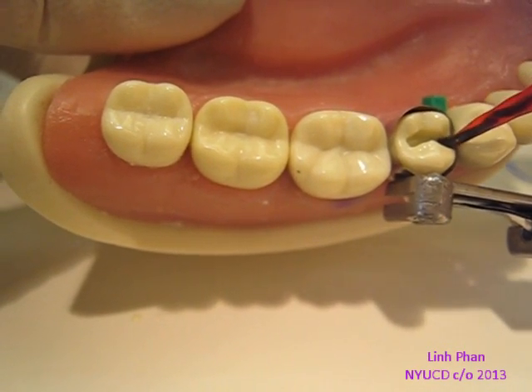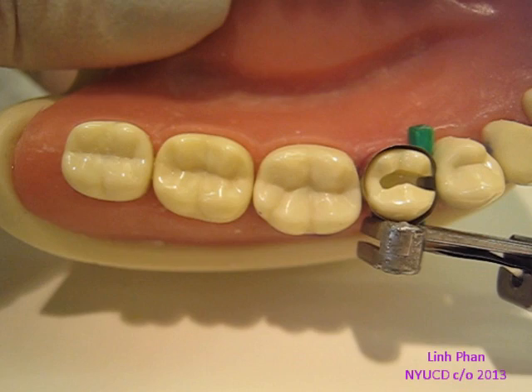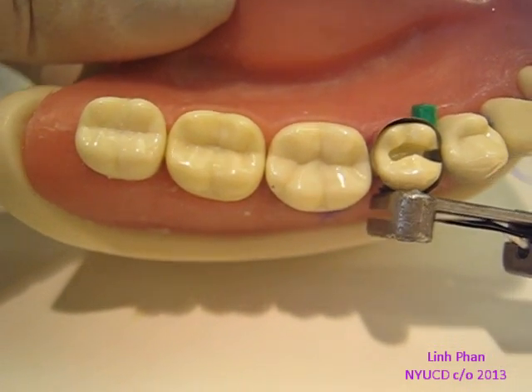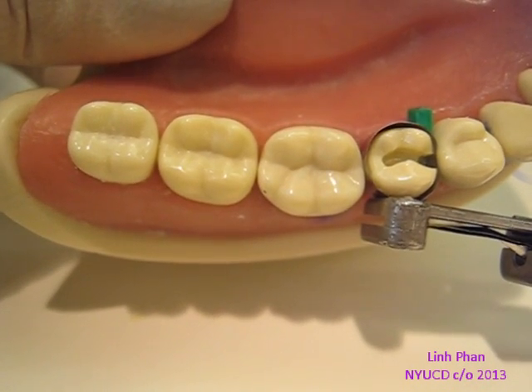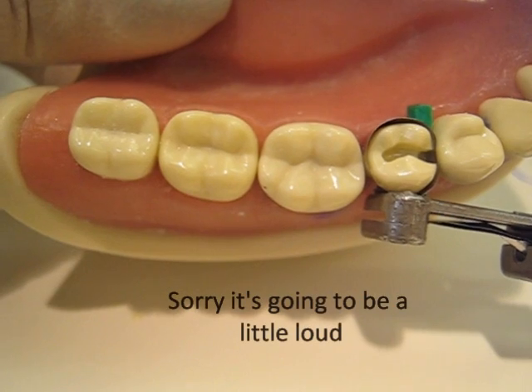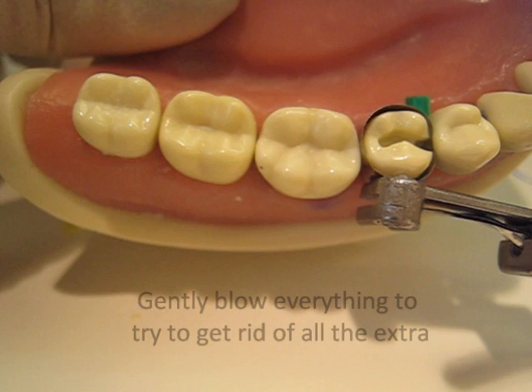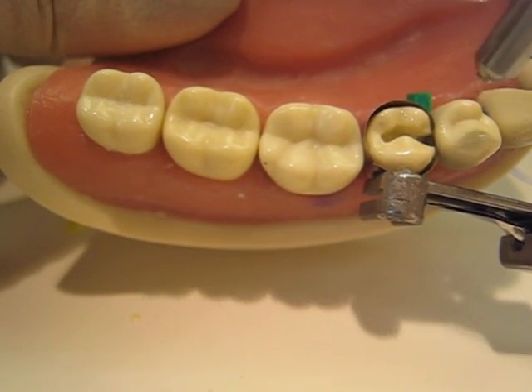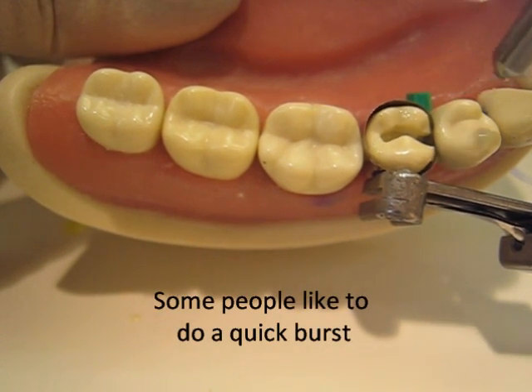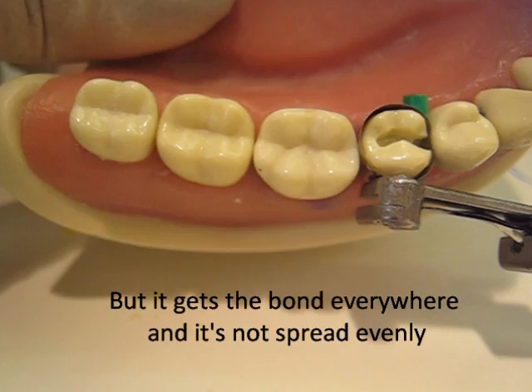I have trouble with pooling in the proximal box. So to get rid of all the extra, you take your air syringe. I usually flow air on my lap first, or on my hand, to make sure there's no water in the tube, because you don't want that. And you gently — just gently — blow everything to get rid of all the extra. Some people like to do a thick first layer, but I think that makes everything just uneven. So blow it gently, and then we're going to cure it.